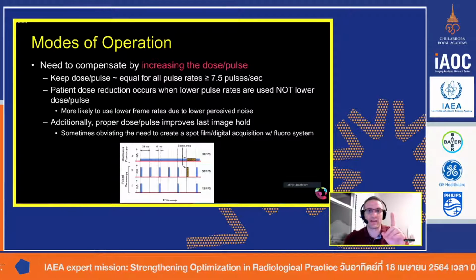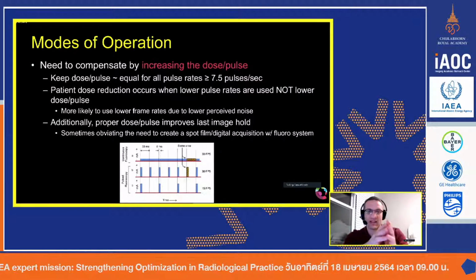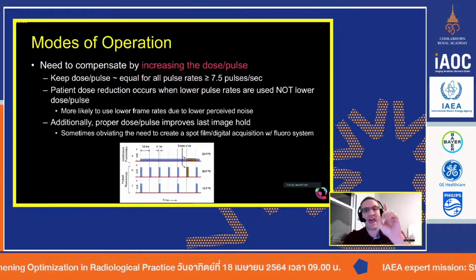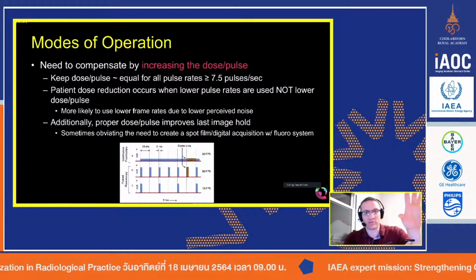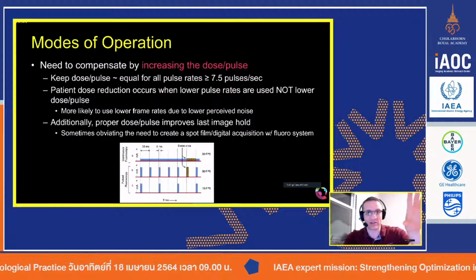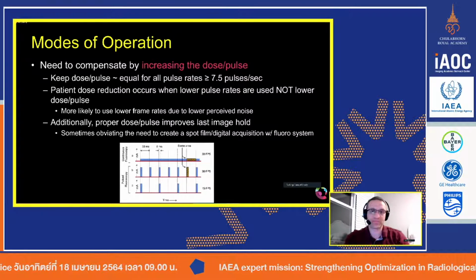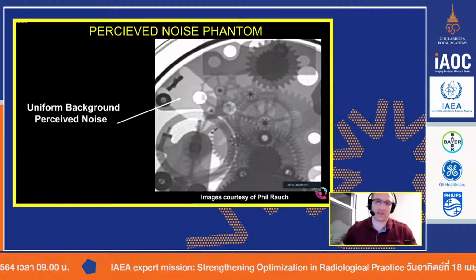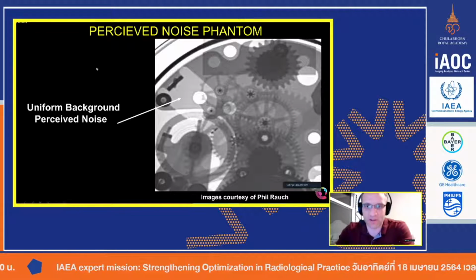So you're going to find that we need to get the right dose to the detector for each pulse, so the image quality looks good in real time. And so when the last image is presented, the image quality statically also looks good. So let's talk a little bit about this. Actually, not talk about it. Let's present a couple of examples.